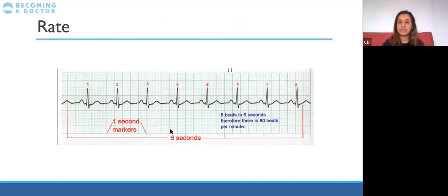The other way to do it is, usually at the bottom of an ECG, there is a rhythm strip, which you can use to calculate rate, because that tends to be 10 seconds. This is the biggest ECG hack that I learned in real life. Obviously, in a spotter exam, they're not going to give you that rhythm strip, and you need to know the ways of doing it properly from the RR interval.